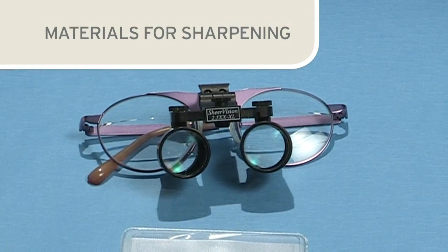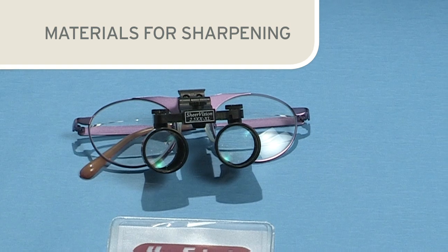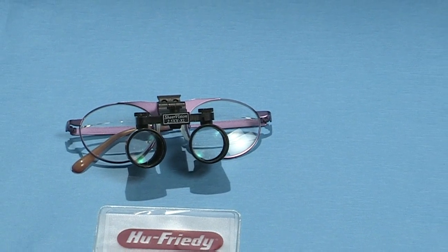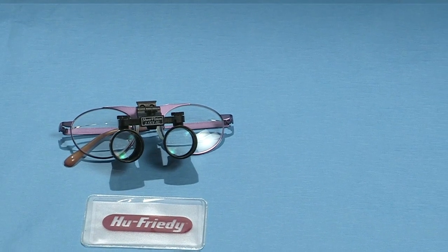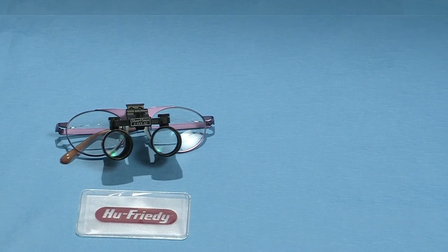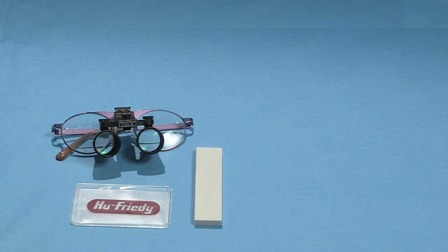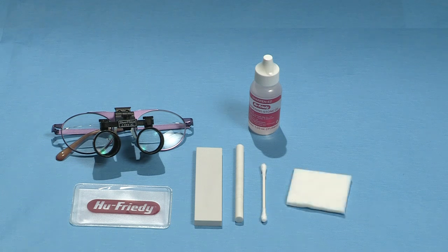Before beginning the sharpening process for sickle scalers, assemble the required materials. A sturdy flat work surface with proper lighting is essential. The use of loupes or magnifying lens is essential to clearly see the edges of the instrument blade. Also needed will be a flat sharpening stone, a cylindrical stone, oil or water for lubrication, depending on the type of stone, cotton-tipped applicator, gauze, an acrylic or plastic test stick.